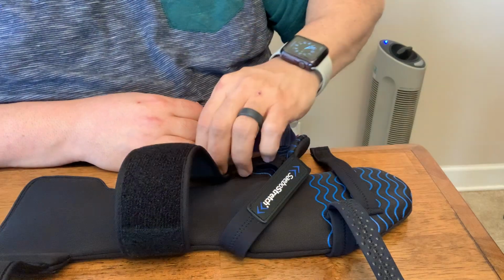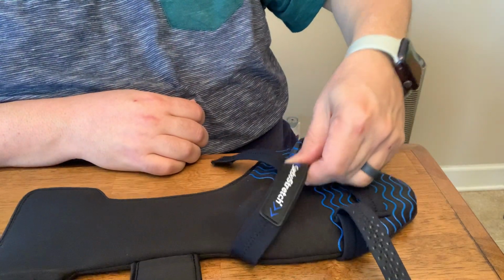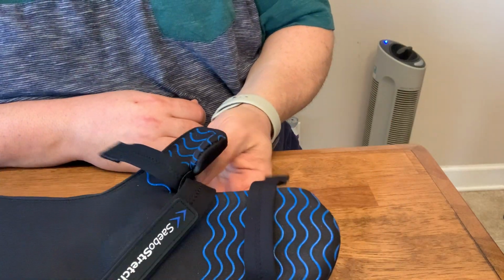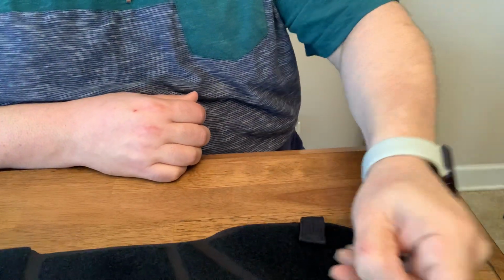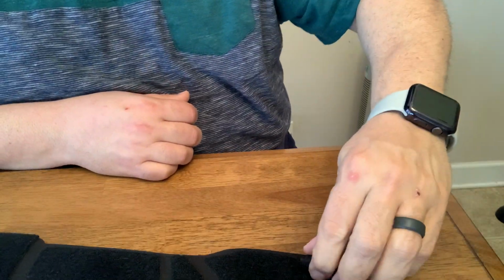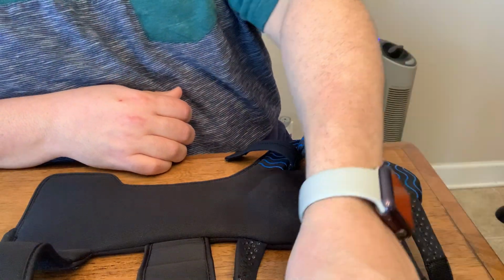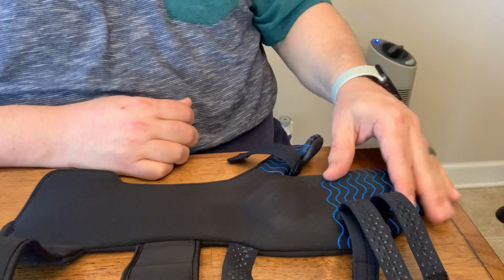Open up all your straps. They get all Velcro-y together, so you've got to make sure they're apart, okay? Make sure all your straps aren't Velcroed on. Hold on, see, there's Velcro here. Got to get that open. Got to get that one open. So you've got them all unvelcroed, okay? You just lay them out so you can put your arm in.